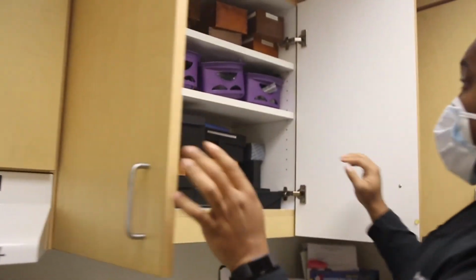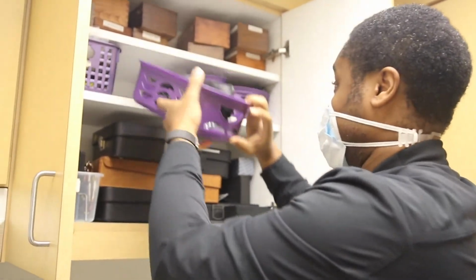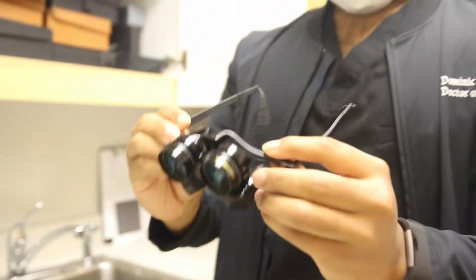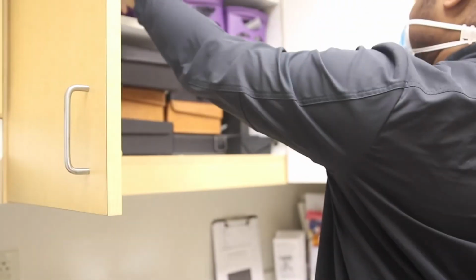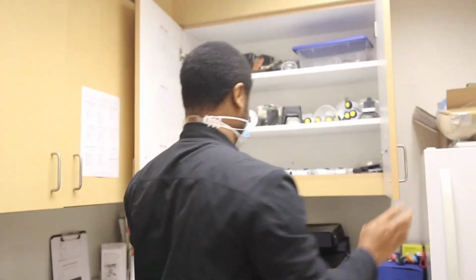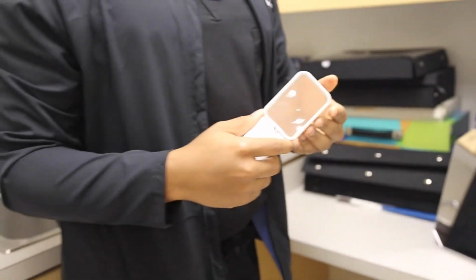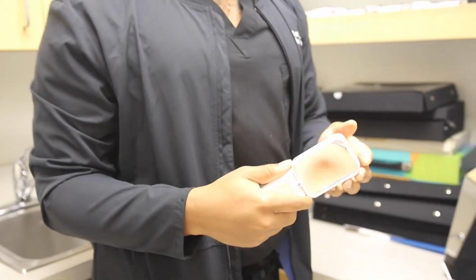In these cabinets, we hold a lot of our magnifiers. So we have sight scopes and telescopes. And these will help patients with their distance viewing goals, like if they want to sit down and watch a movie or go to a sports game, these devices can become very helpful. And over here, we have a lot of hand and stand magnifiers. That way, if a patient wants to be able to read more functionally, we can provide them with that magnification and equivalent power necessary to do so.